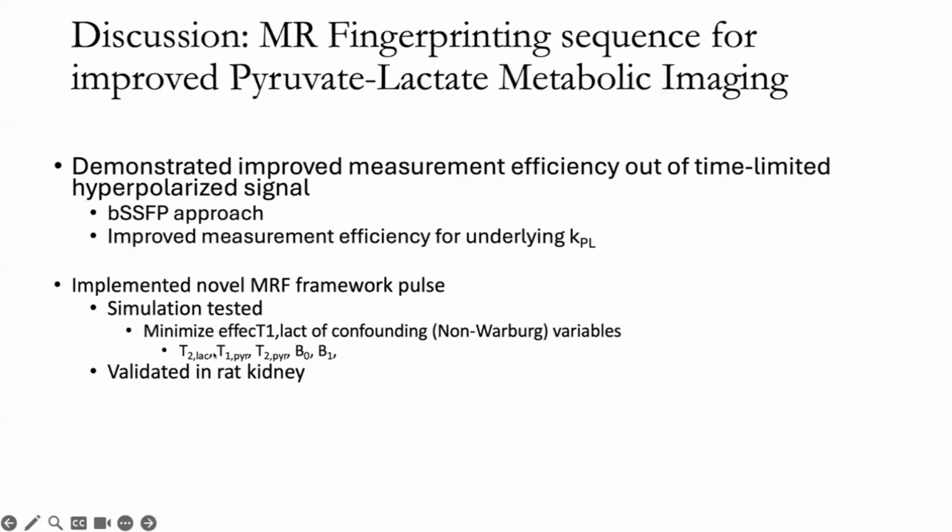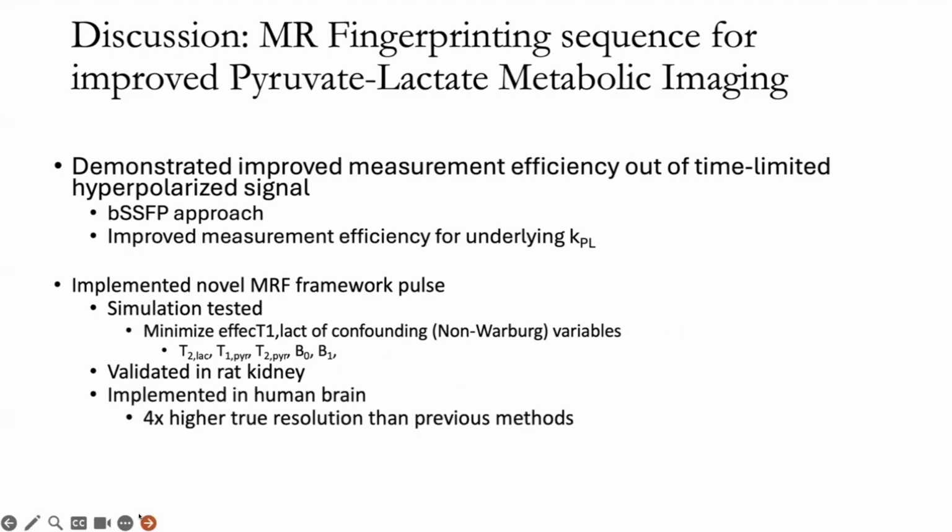Then we did a decent validation experiment in rat kidney. And now we've also implemented it in pilot experiments in human brain. Our resolution here is true 7.5 millimeter in-plane, 15 millimeter through-plane, which is approximately fourfold higher than the lactate resolution for our most recent variable resolution approaches.